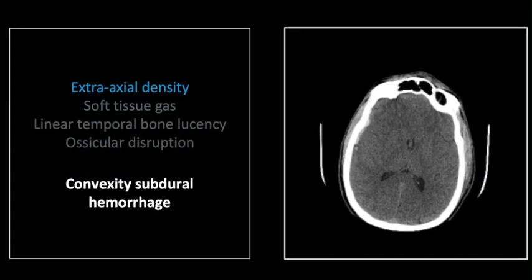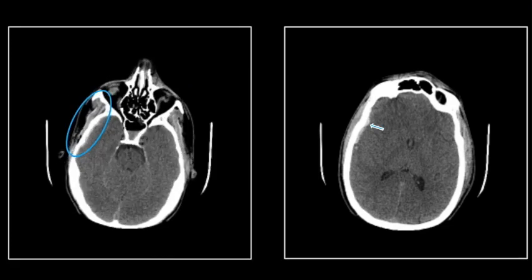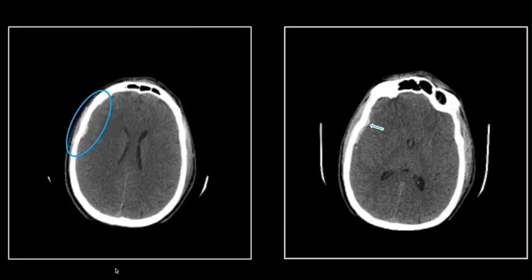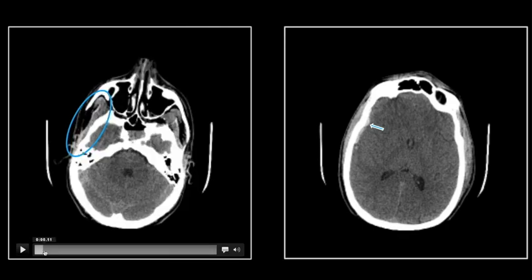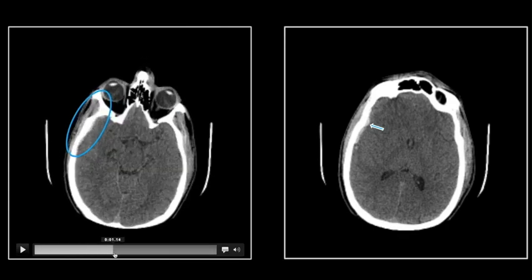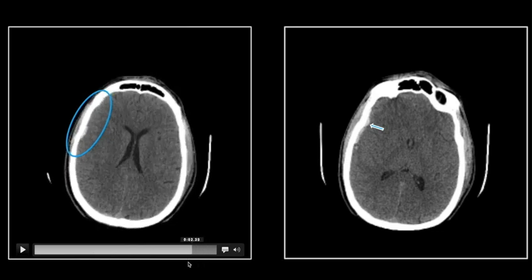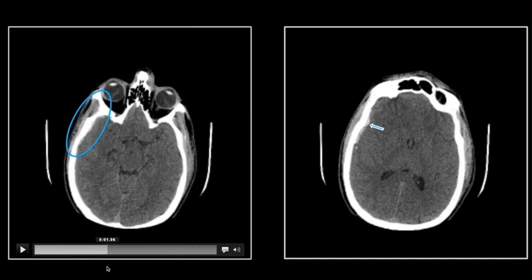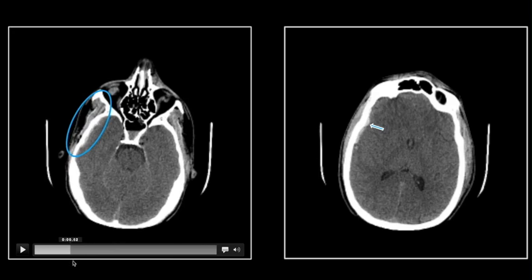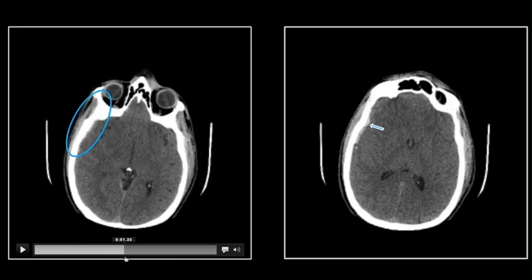Our next case is a typical convexity subdural, this one post-traumatic. You can see it here, relatively thin and somewhat irregular. It is not the most obvious thing, but certainly not of such subtlety that it would necessarily be missed. You can see the subdural, of course, crosses suture lines, this one extending over the temporal pole.